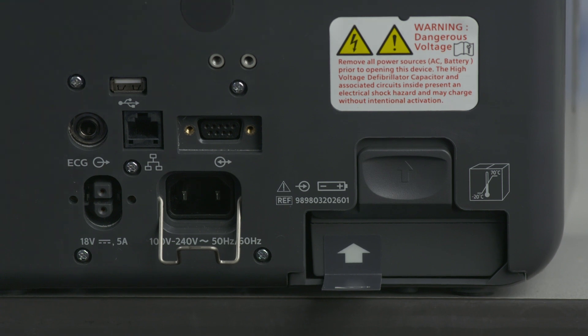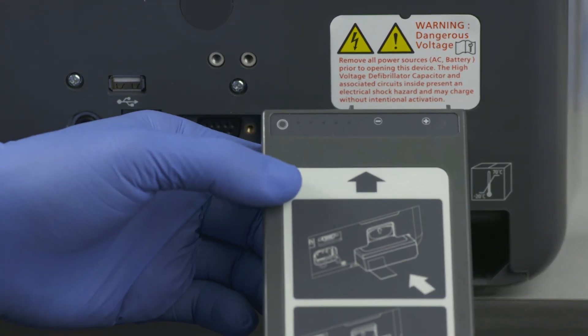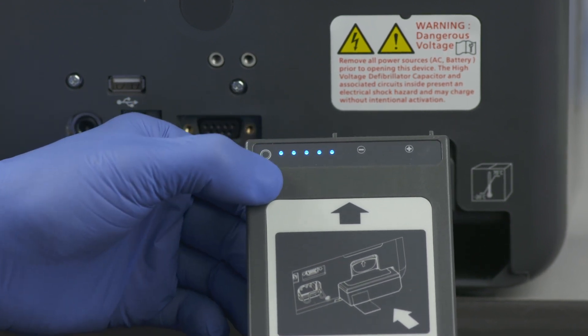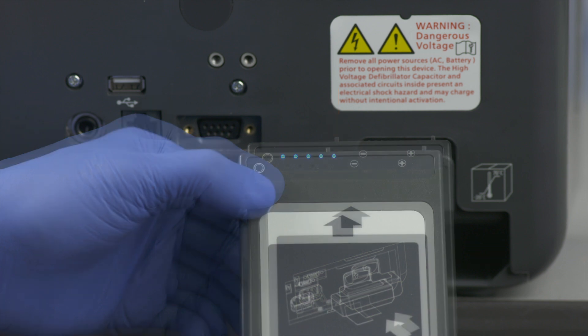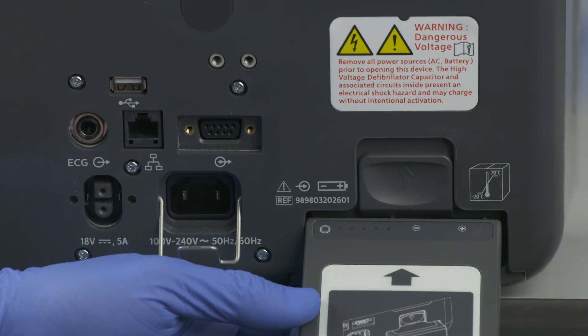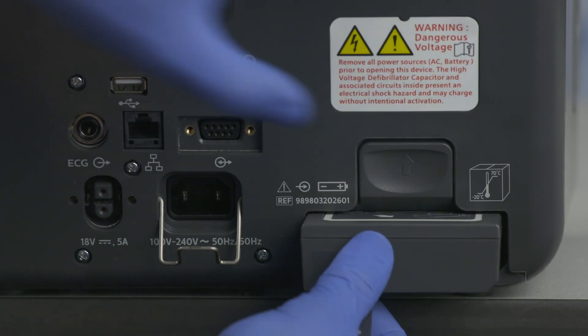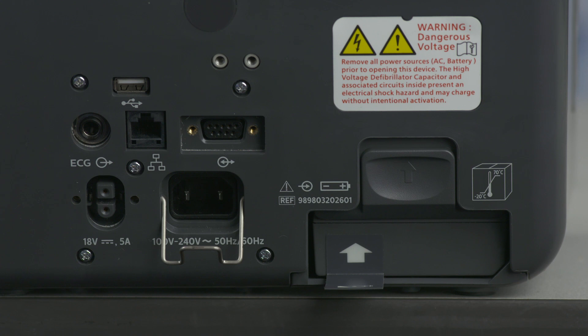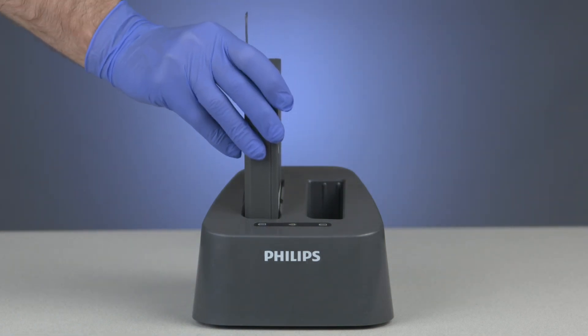On the back of the device is the battery compartment, which houses a rechargeable lithium-ion battery. The battery has a power gauge at the end opposite the battery tab — each solid blue light indicates approximately 20% charge. A flashing blue light farthest from the button indicates the battery is too weak to operate the device and must be recharged. To install the battery, align it in the compartment with the arrow on the battery tab pointing up, push up on the tab, and insert until you hear the latch click. Connect AC power here to charge the battery.